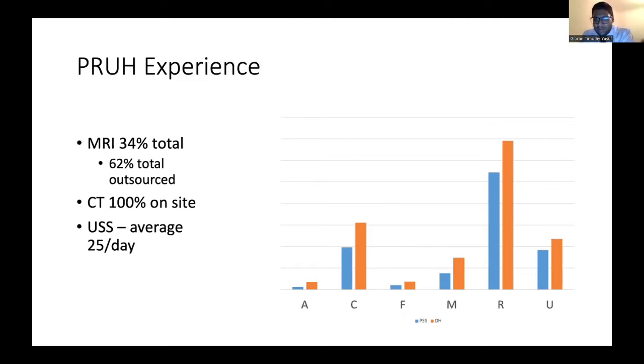And that's quite difficult as well, because CT will always be a modality for acute imaging. And it should always be a modality. It's rapid, it provides an easy onset. So it's a matter of whether or not people are selective enough when they do it. But it is inevitably congested. Add into that things like CT colons, which are becoming widespread, cardiac CTs, which are widespread, biopsies, which are widespread. These all take much longer than your average CT scan. So you face a problem where you are trying to squeeze things into CT left, right, and center.